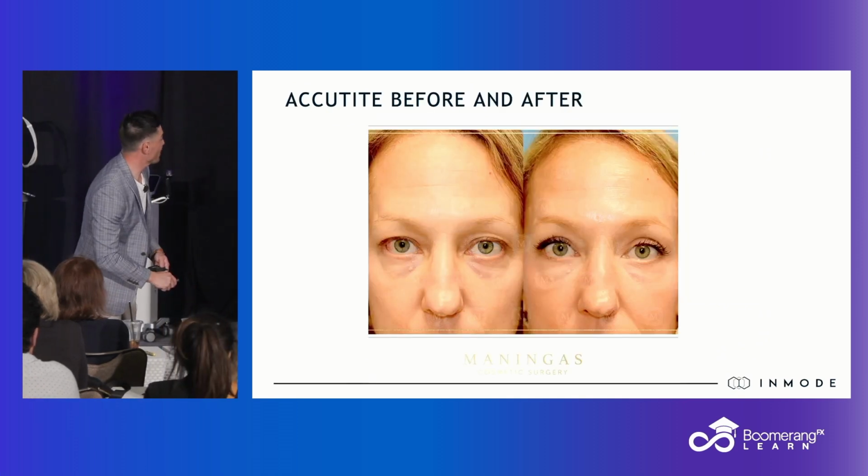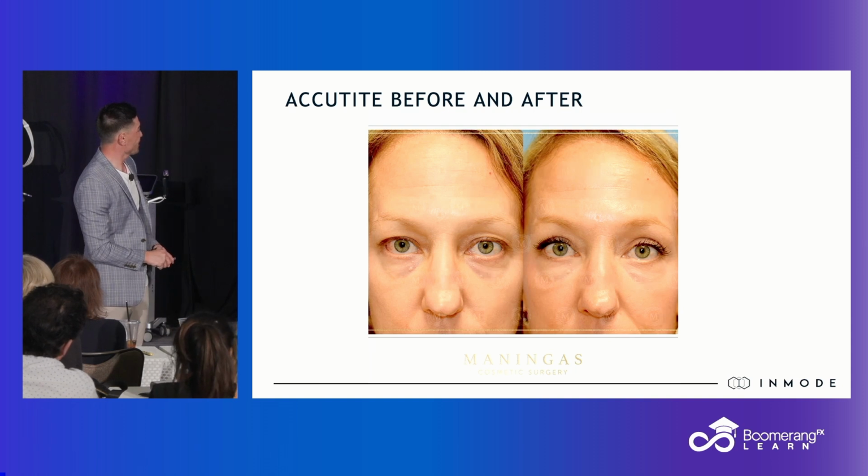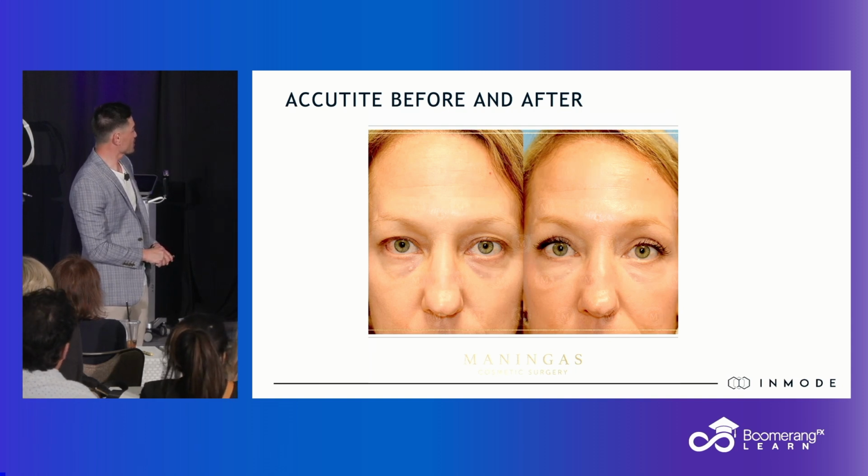Okay, this is the lateral brow. It's hard because she's got blonde skin, but just look at her supratarsal crease. This is the supratarsal crease.